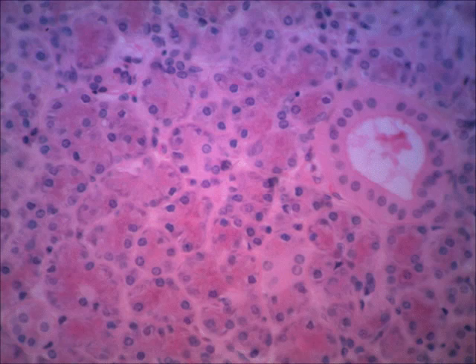If we move to another slide, be patient. Okay, here you see just another view of it on the higher view. Notice you can see the duct. That's real easy to see on your right-hand side. But look at the various other clusters. You see that the cytoplasm stains differently in some of the cells. That just has to do with what chemical component that cell produces for the saliva.